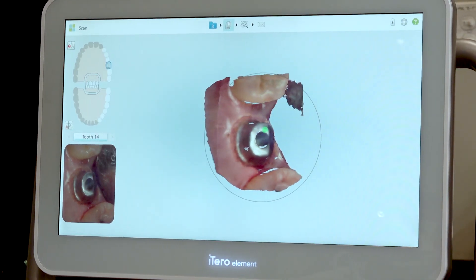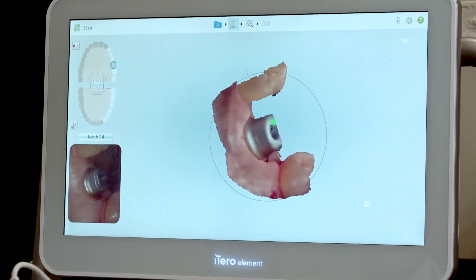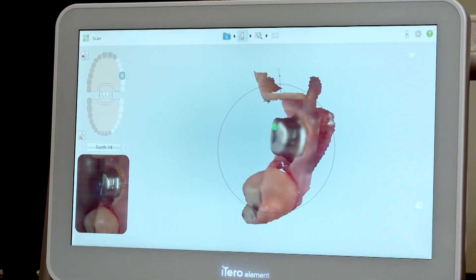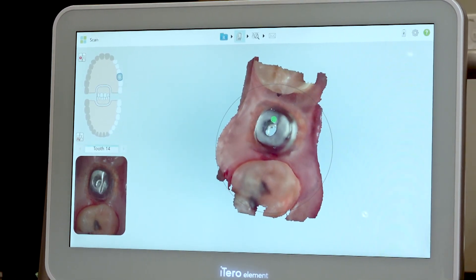I'll start the scan directly over the occlusal and then slowly rotate the camera to capture the lingual and then buccal. When transitioning from one surface to the next, rotate slowly to allow the scanner time to stitch the data.